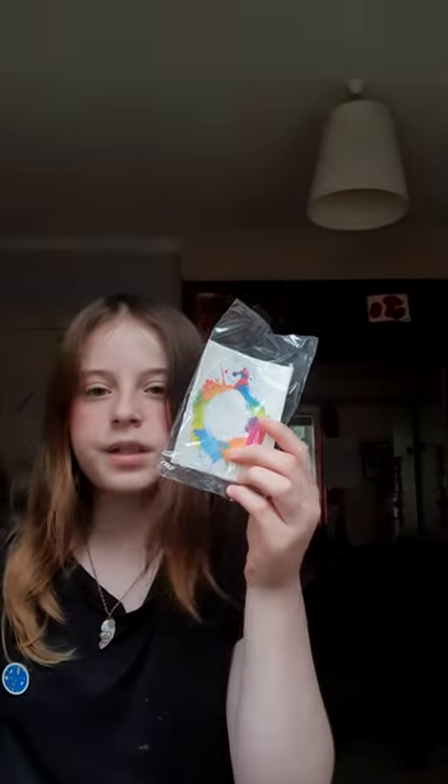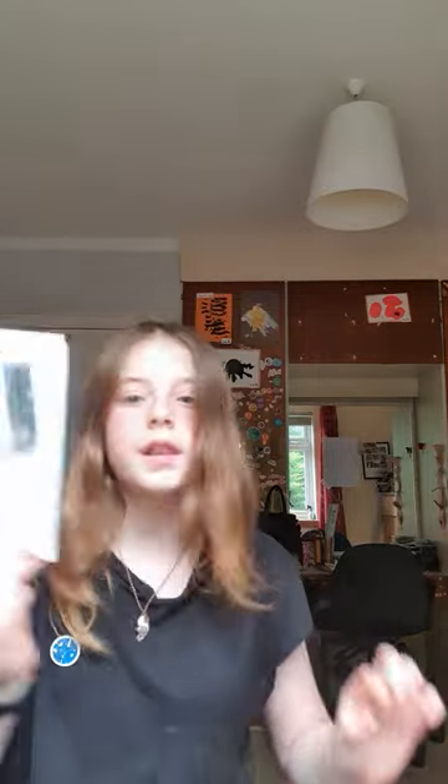So here's all the things you'll need: a Dexcom G6 sensor, some patches if you want some, a cannula, the actual insulin, the cartridge, and the needle.